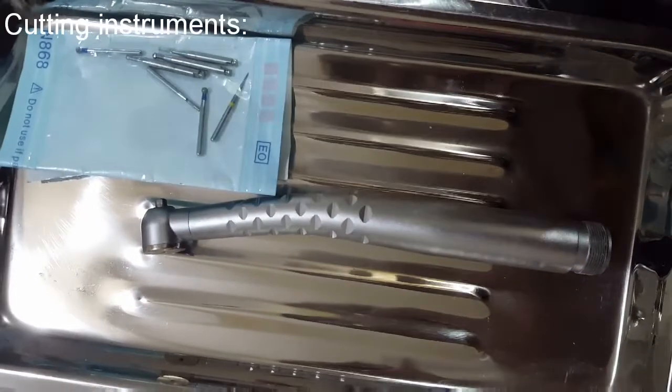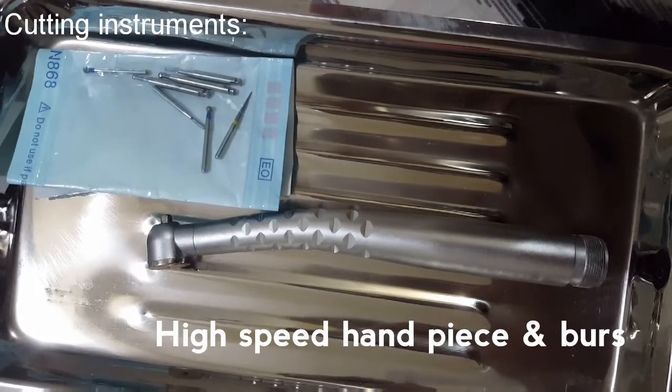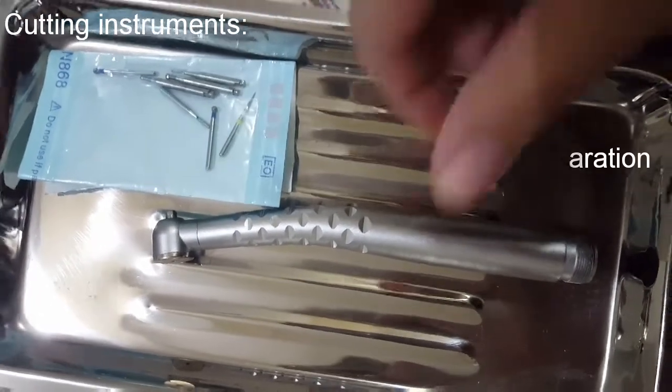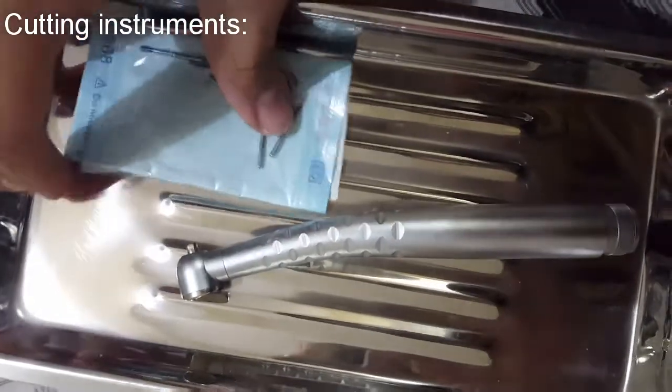Next come the handpiece. This is not exactly required in the filling, but it's required in the cavity preparation, which is done before the filling. So this is our high-speed handpiece, and these are the burrs, or some of the burrs that we usually use.